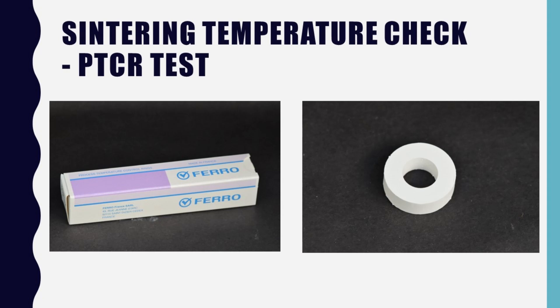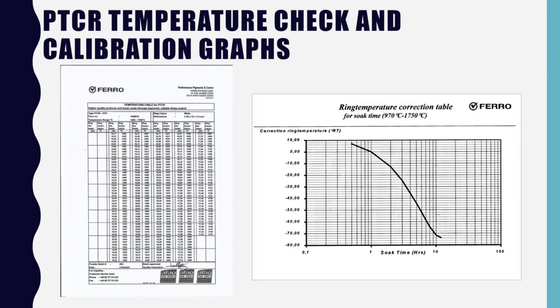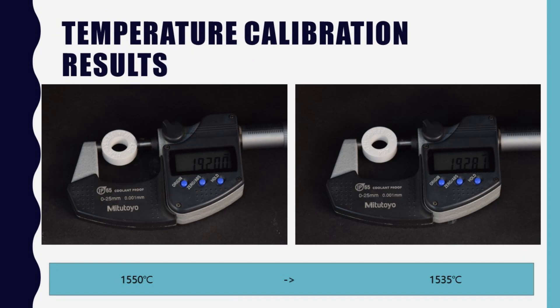A test ring can be used to measure the actual temperature by measuring the reduced size after a sintering cycle. You can measure the shrunk size and find the corresponding temperature in the table on the left, which is based on one hour. You can use the table on the right to compensate for holding time at the highest temperature during sintering. The recommended temperature of the material is 1,530 degrees. I set the display temperature to 1,530 degrees, but the actual temperature measured was 1,550 degrees.